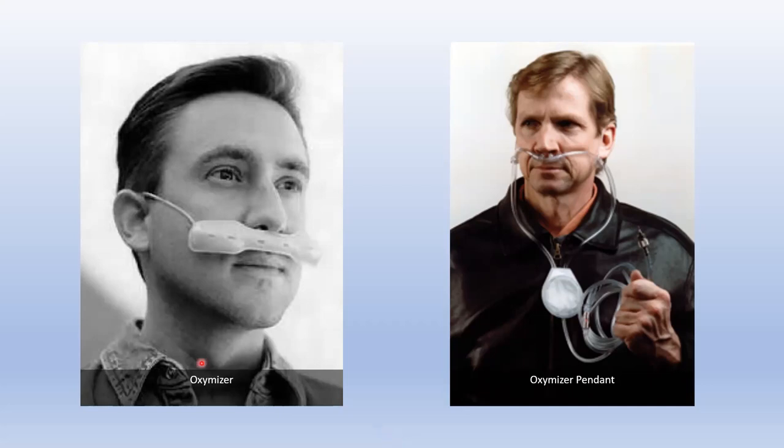Okay, great. So the purpose of the thing over here is going to be the harvesting of exhaled oxygen. Okay? All right, Pierre, you will see this quite a whole lot, particularly when they come from the home. You will not see this much in the hospital, but patients who are in the outpatient setting probably will be using this quite a whole lot. When you see them outside, like in the grocery store, you would see this.